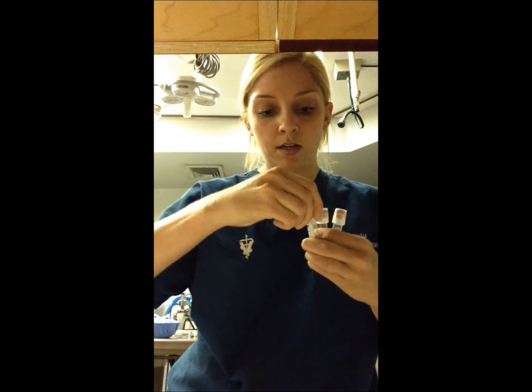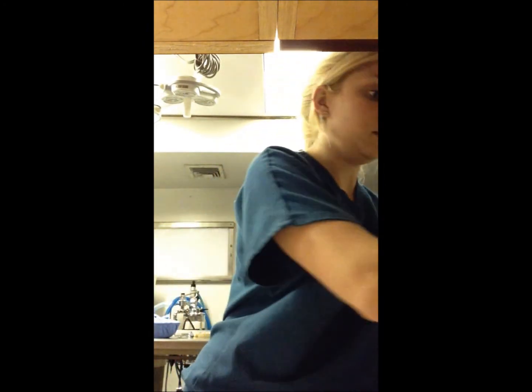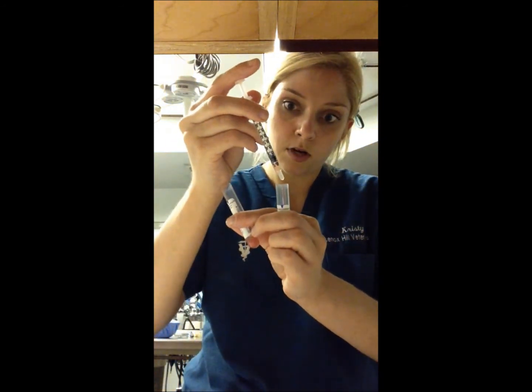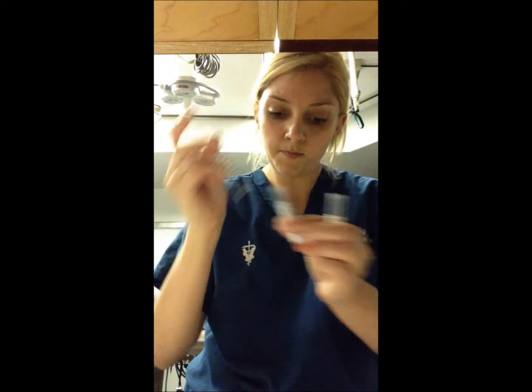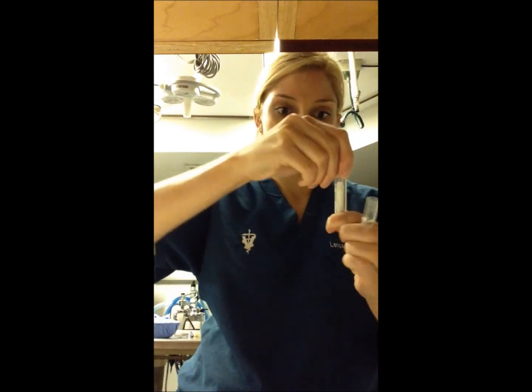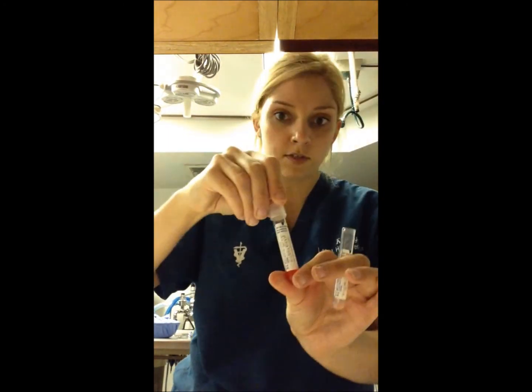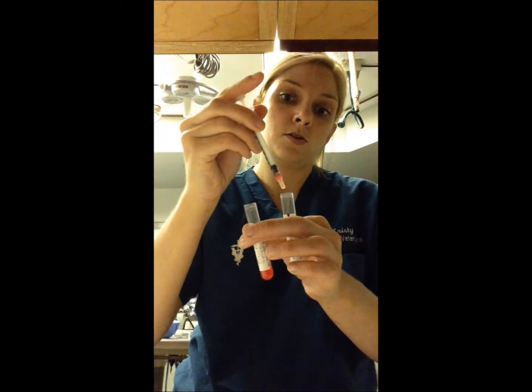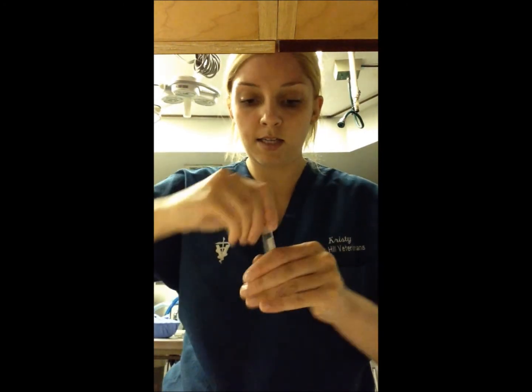So this is Ethel's serum, and this is Ruby's erythrocyte suspension. So we have a nice clean tube here. We'll take the serum first. You're going to take a little bit into a syringe and drop 2 drops into the vial. Okay. And then we are going to take the erythrocyte suspension and a new syringe, and you're going to take some of that as well, and drop 2 drops in. 1, 2. Okay. Put that back. Mix slightly, and allow that to incubate for 30 minutes.